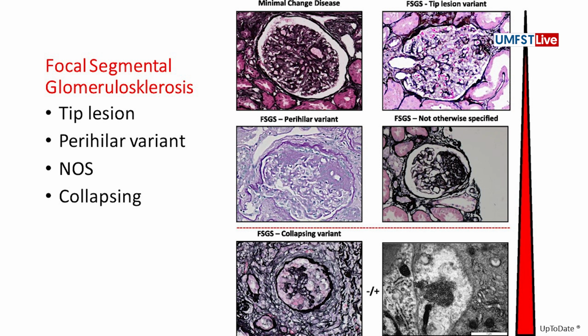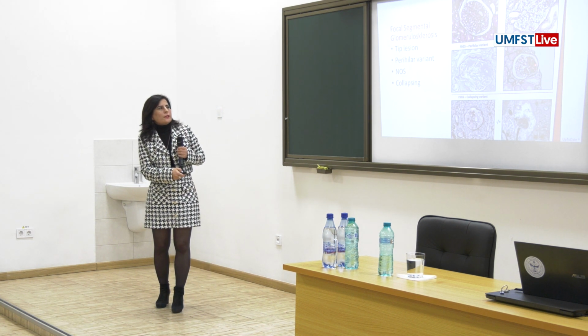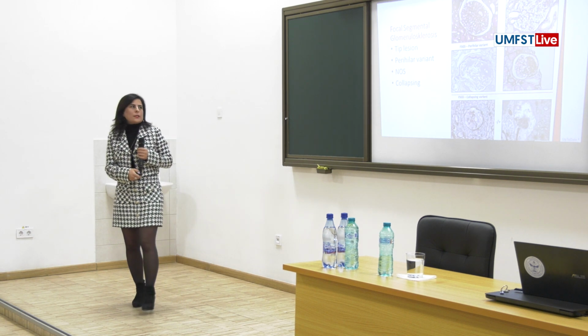Here, it's the opposite part. It's the urinary pole of the kidney, glomerulus, and you see here the sclerosis. I think this is not a sclerosis. Maybe from far away I mixed it. This is the perihilar variant because here you see the hilar area and just according to less than half. And this is not perihilar, but you cannot specify it. The lesion is focal segmental sclerosis here.